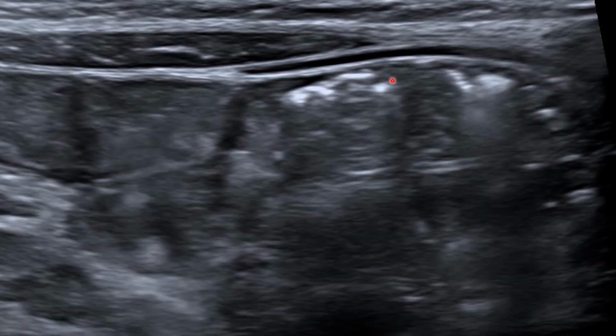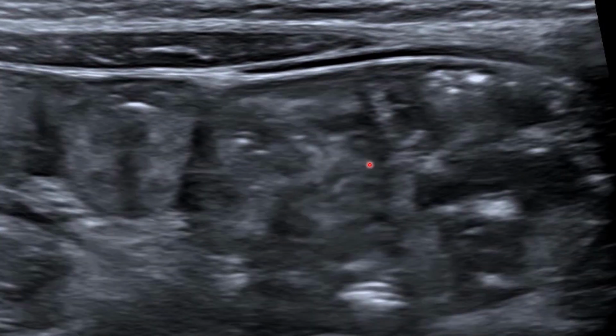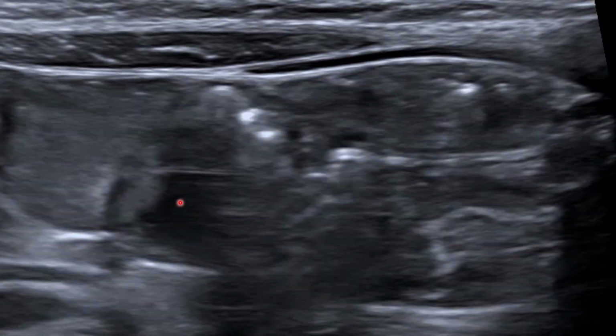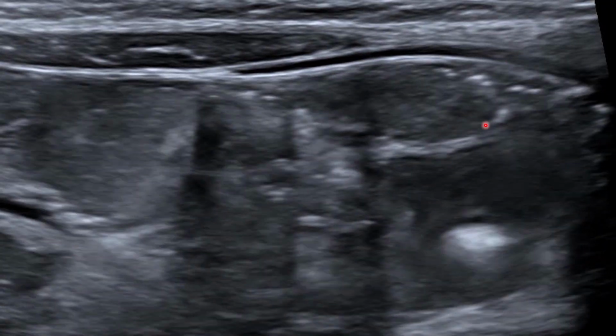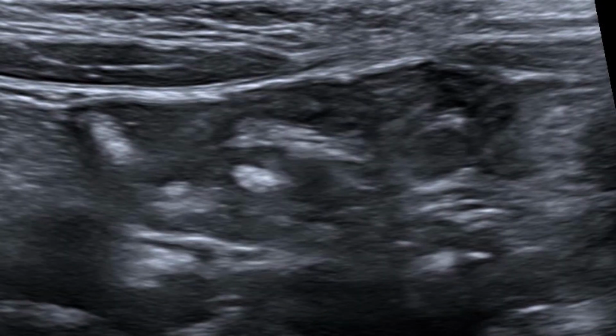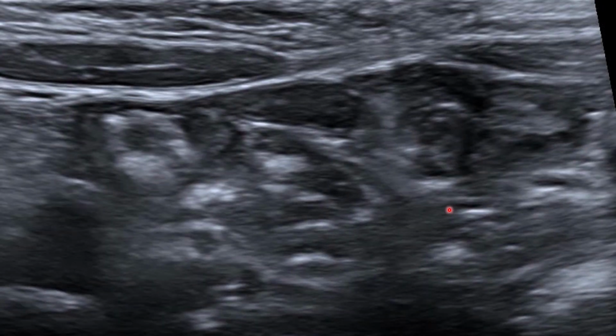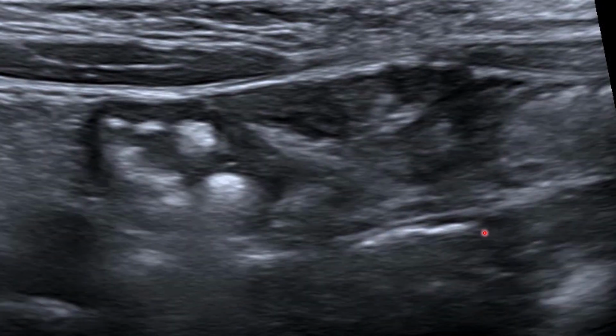Then if you can pick it up from there, it will be easier for you to pick other pathological entities. Even appendicitis, you can pick it. So this is a bladder there, so you can see how the intestines are moving like that.